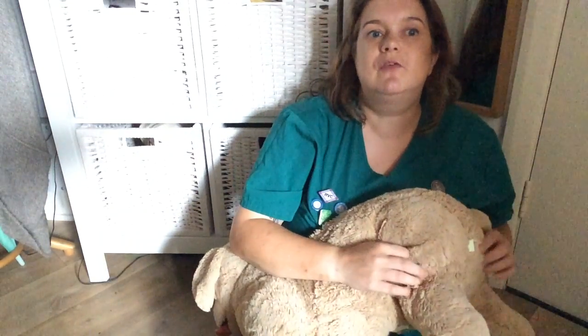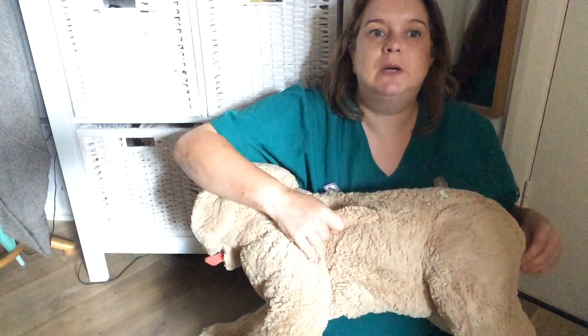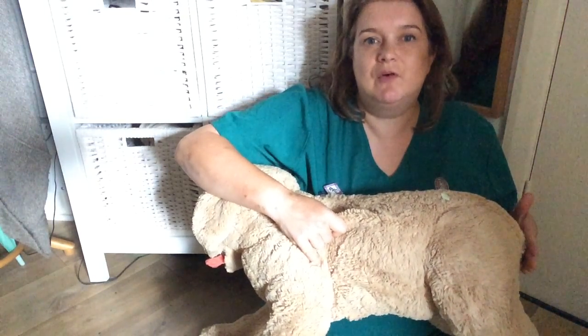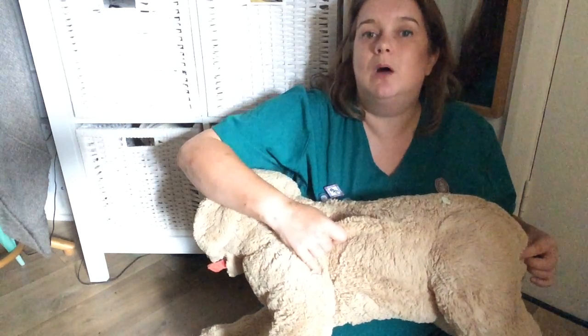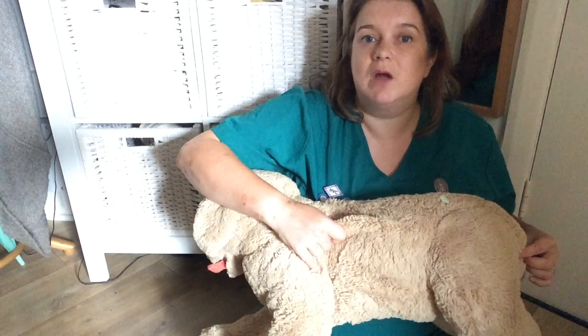Our caudal landmark — I've already put this on here. That's our little bum bone. So our ischium is our little bum bone. If you think that that is kind of as far back as the skin goes, you'll see the bum bone — the ischium — really well on things like greyhounds and lurchers.